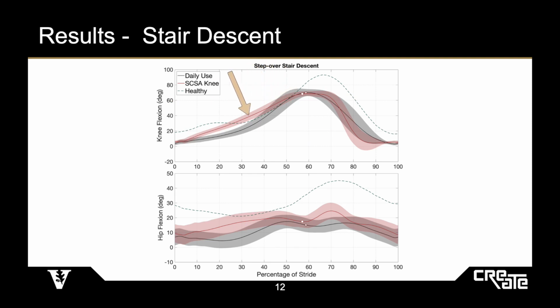The damping values were tuned to user preference, and this could be tuned to match the damping profile of the Rio knee. The addition of power is visible in the swing phase of gait, as our device injects a small amount of torque to make sure the leg reaches full extension quickly. This is not necessary, but our participant preferred it.